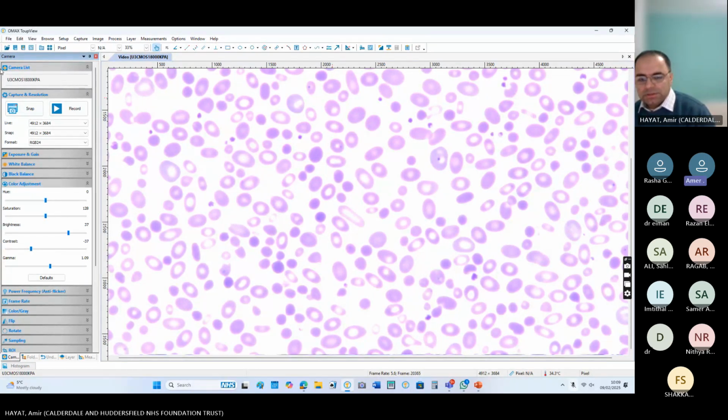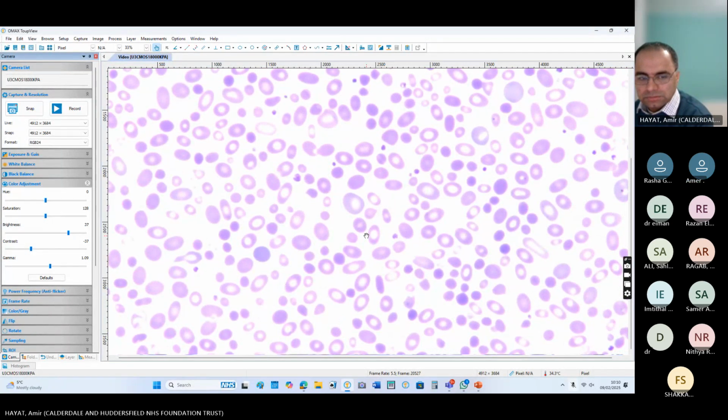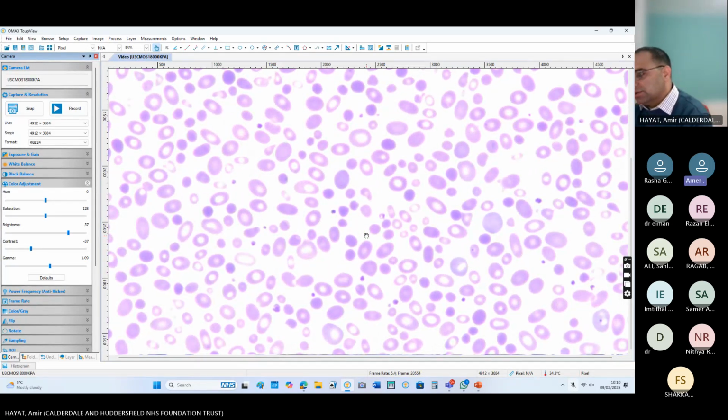If it was spherocytosis, then you should have only spherocytes. If it is elliptocytosis, then you should have only elliptocytes. I think I showed you the elliptocytosis before, which is full of elliptocytes like this. They don't have macrocytes or spherocytes or teardrop cells. Is it autosomal recessive or dominant?